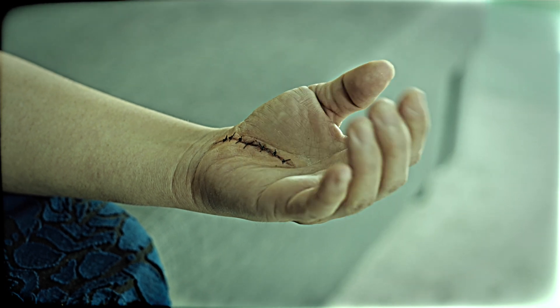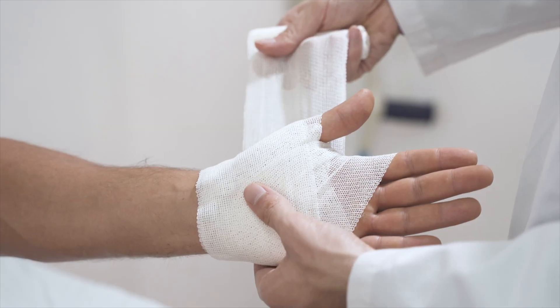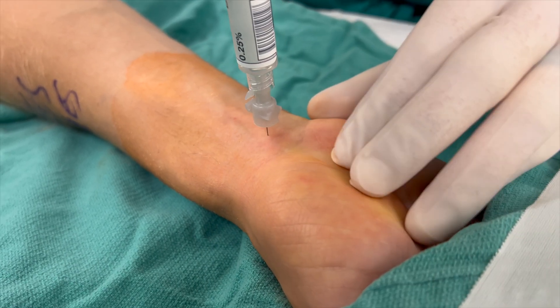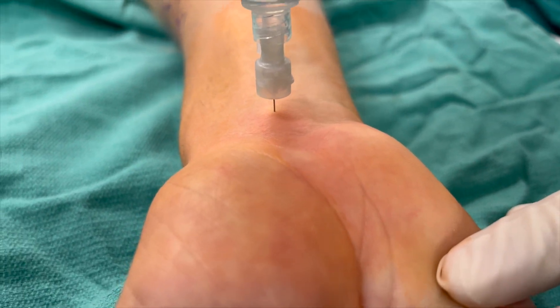There are times when you need to numb the hand for surgery or a procedure in the ER, and a digital block is just not enough. And at the same time, a brachial plexus block that numbs the whole arm seems like overkill. In these situations, it's super useful to know how to do a wrist block, which we'll cover in detail in this video.